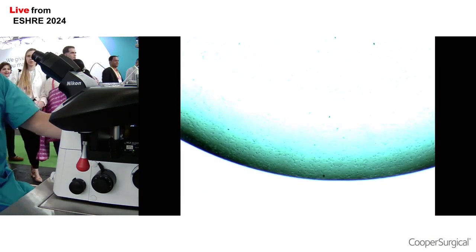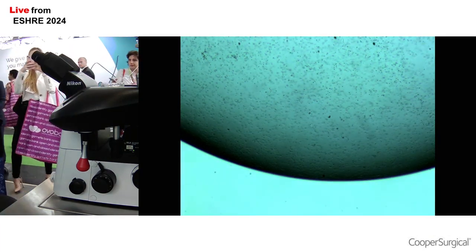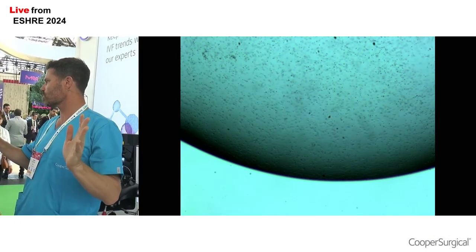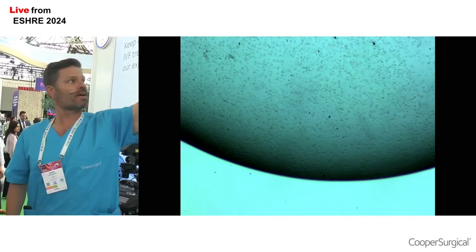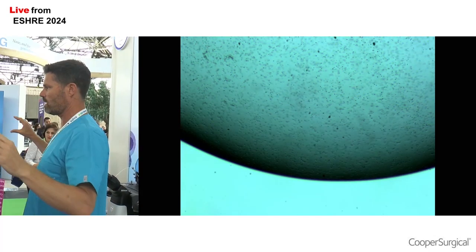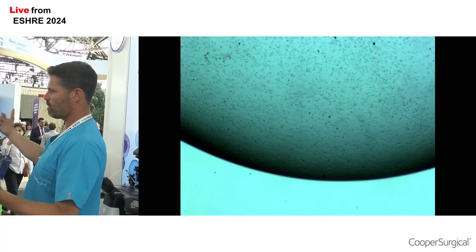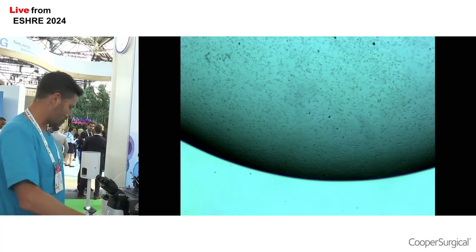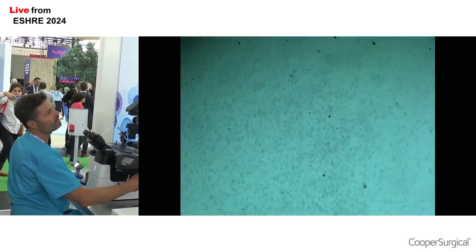This basically is the middle drop that I prepared. The one with no sperm, no SpermSlow, just the media. The sperm I placed over here, and the SpermSlow I placed on that side of the drop. So what I effectively did was I created a small microfluidic channel, so the most motile sperm are going to swim towards the SpermSlow. And what we're going to do is I'm going to go to the edge of the drop, the upper edge of this drop.